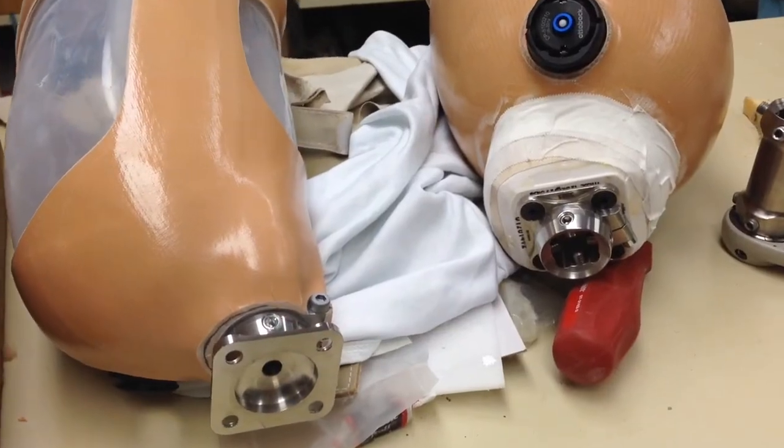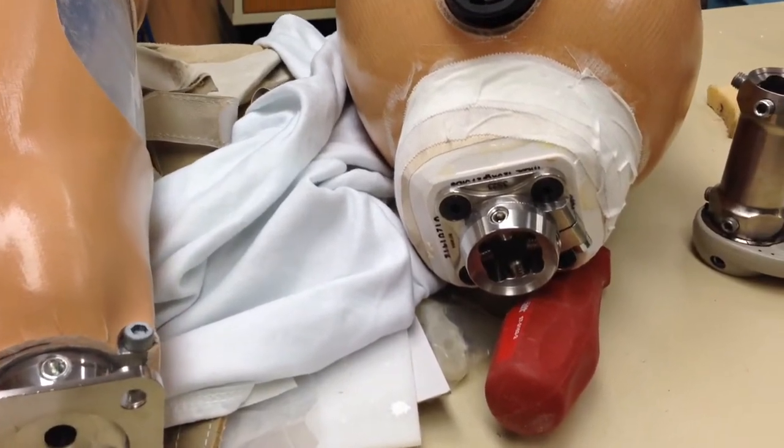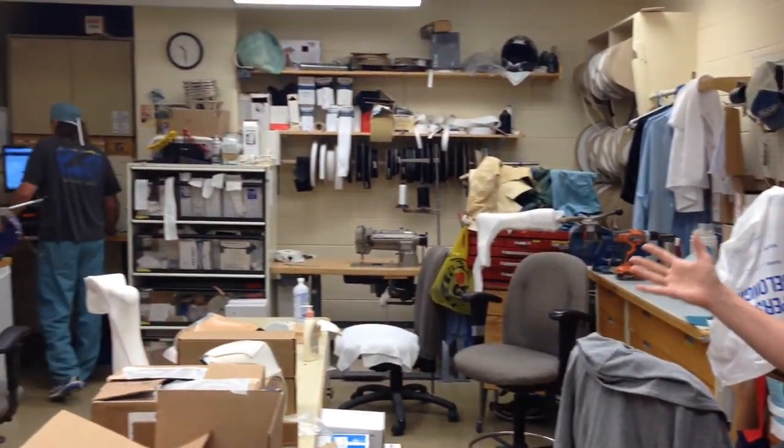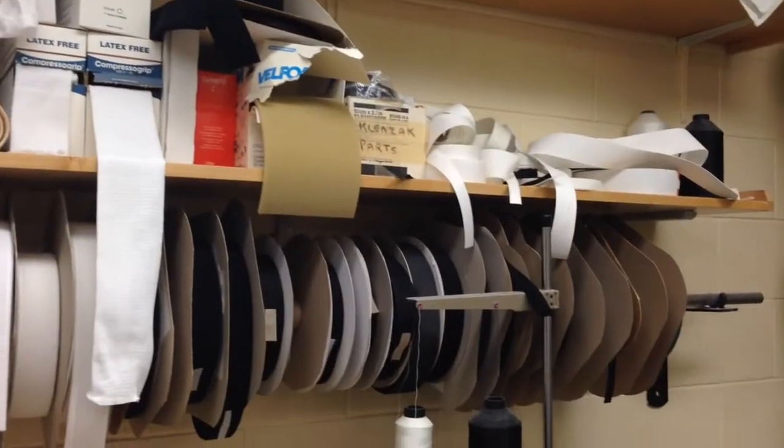Once we have our plastic molded, trimmed, and ready to go on the patient, we have to do some finishing touches. All the components we use for prostheses are sent to us from various distributors — we'll get feet, knees, and liners. All of that has to be assembled somewhere, and this is where our three technicians, who are highly trained in both prosthetics and orthotics, do it all.